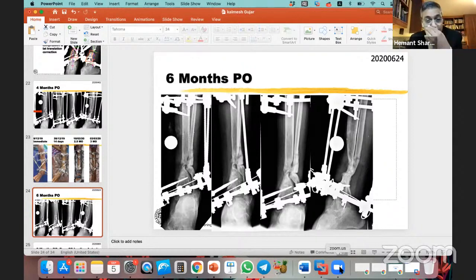And I think your trick of putting an oblique ring is fantastic, and you can see you've dropped the ring more or less to the ankle joint. I generally worry too much when the small fragment is there.